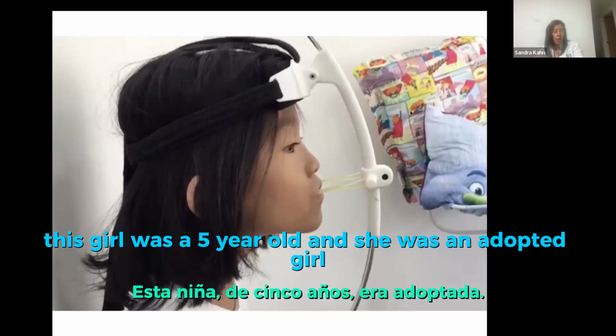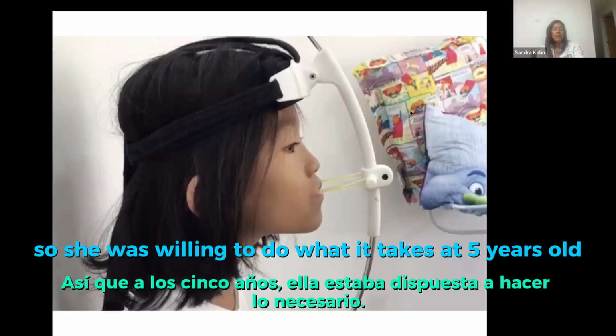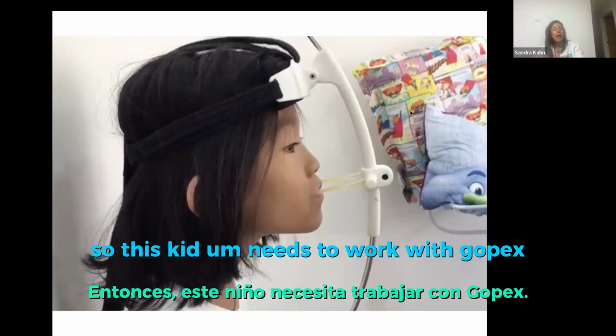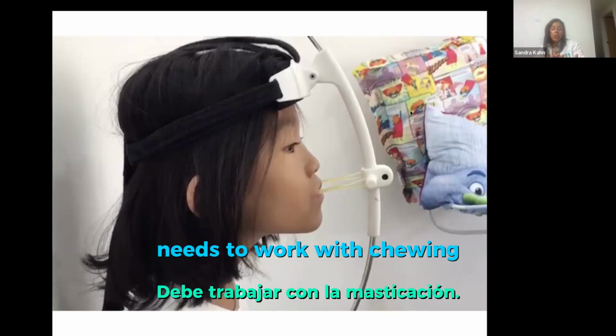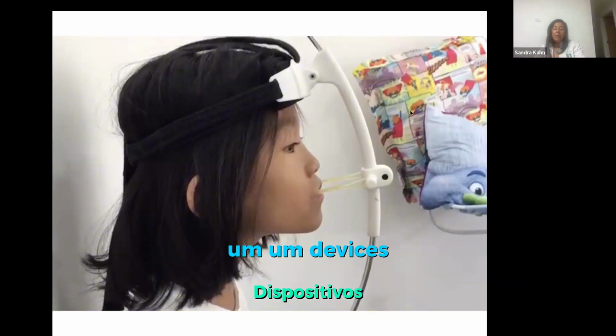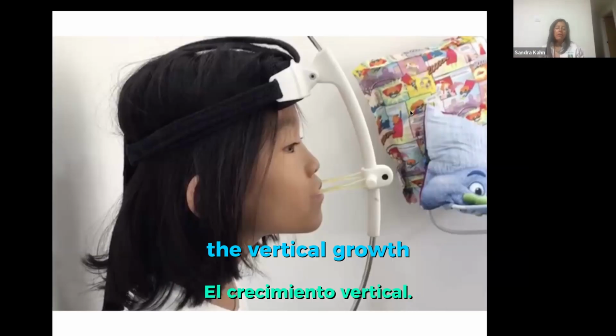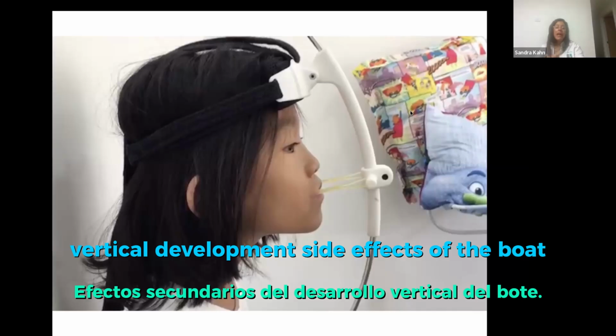This girl was a 5-year-old, and she was an adopted girl, adopted by a pediatric dentist's brother, and she had a class 3 malocclusion. So she was willing to do what it takes at 5 years old. This kid needs to work with GoPex, needs to work with posture, needs to work with chewing. The bow comes in a package with chewies and different devices, but you have to understand vertical growth, and you have to understand how to control the vertical development side effects of the bow.